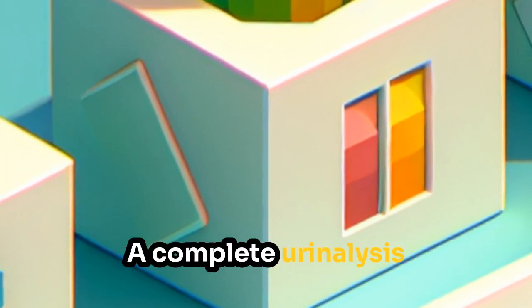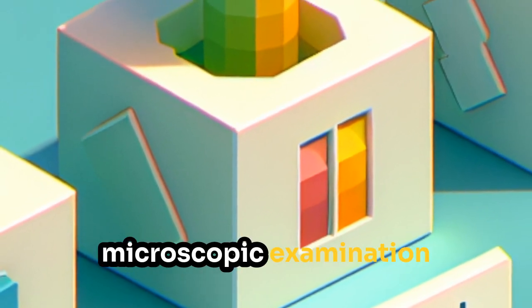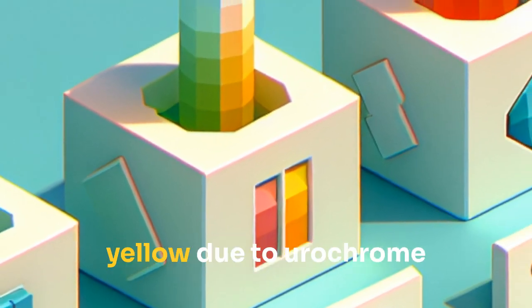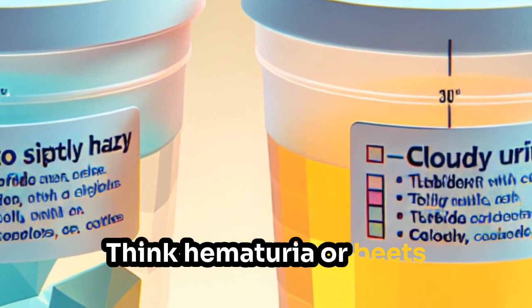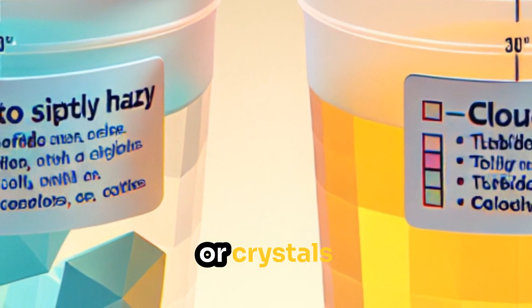A complete urinalysis has three parts: physical, chemical, and microscopic examination. First, the physical exam. Color: normal urine is yellow due to urochrome. Red, think hematuria or beets. Brown may be bilirubin. Cloudy, consider infection or crystals.